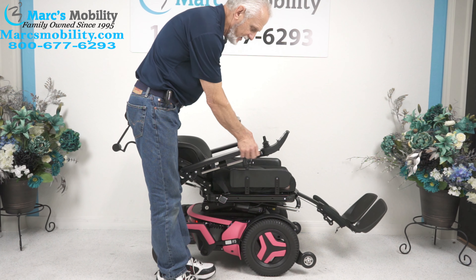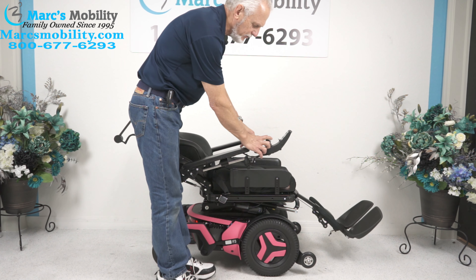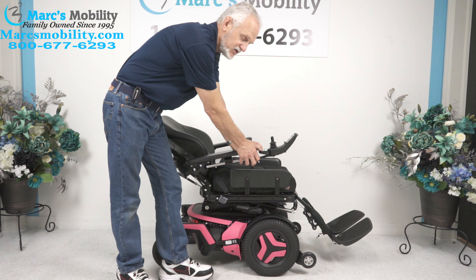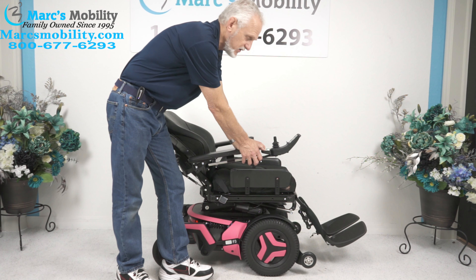If you want to do two functions at once like I'm doing now, you can do it through the joystick with one simple button. These are fantastic chairs — this is the top of the line in power chairs. These Permobils are fully adjustable.